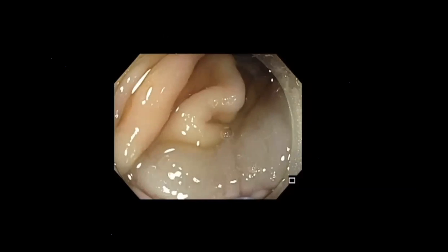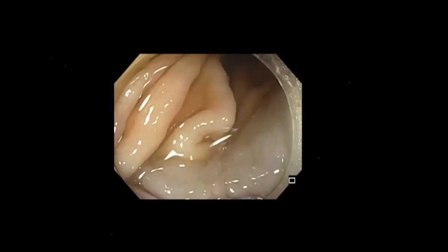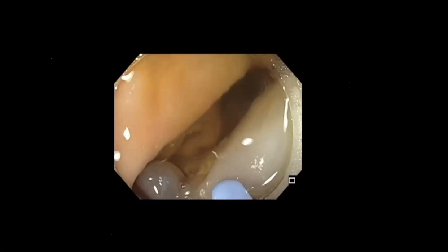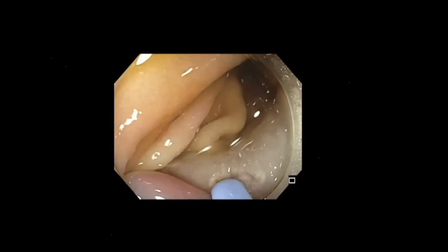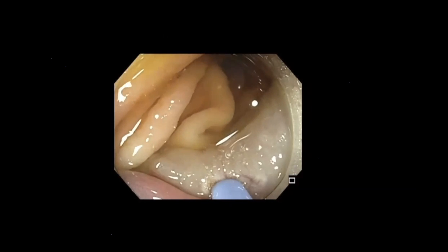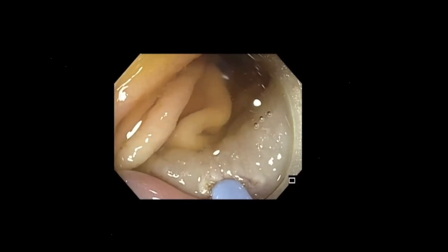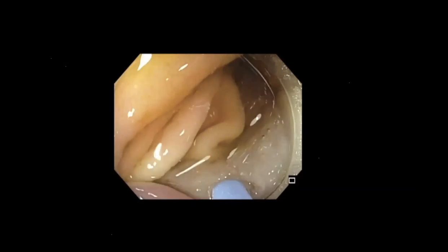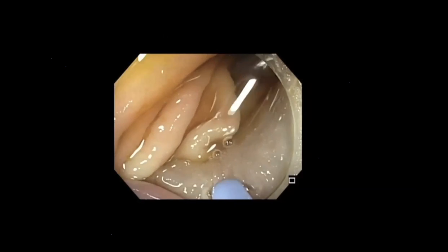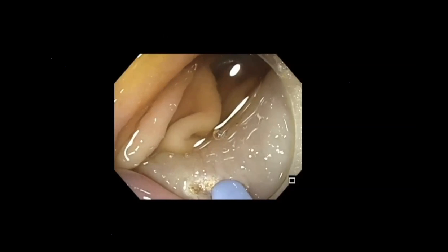coagulate the vessel. I have to admit this, I was very concerned to do this, concerned about her because she was so thin. And I thought that if I don't take all the precautions, I may end up with a delayed perforation. So that's why we injected, we used a very light current, and we wanted to go slow.